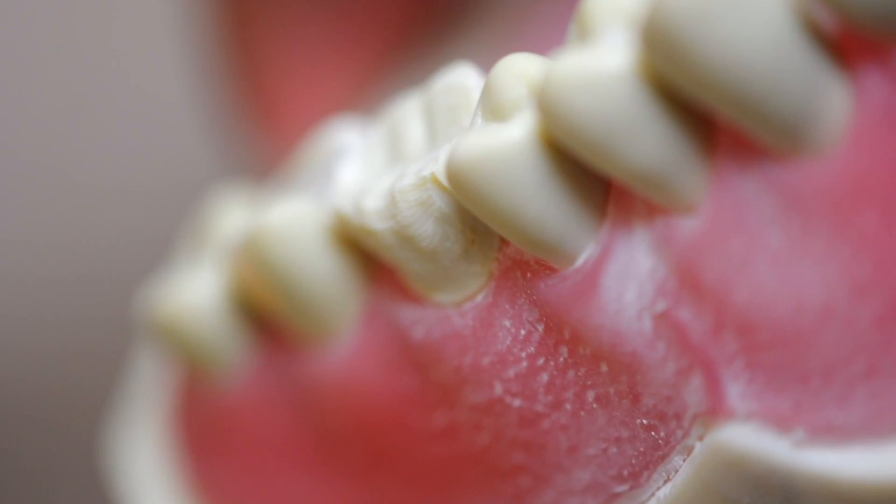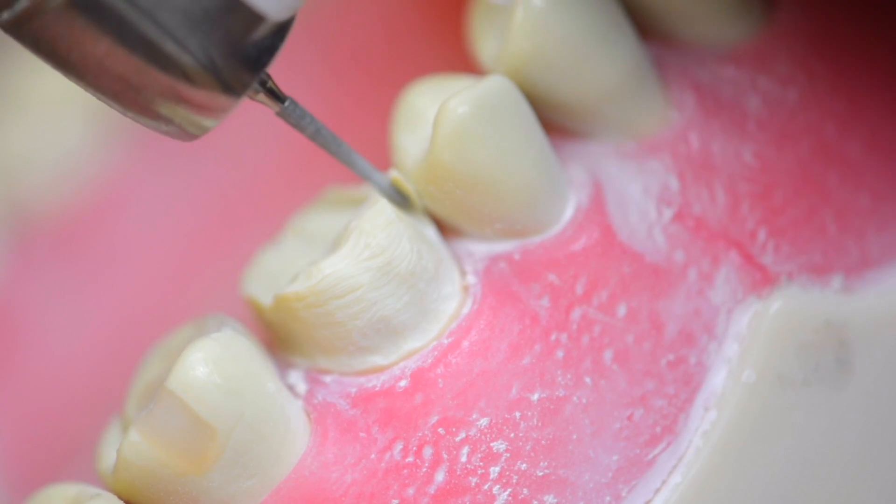Another critically important step involves interproximal reduction. This is a super technique-sensitive step, but if you understand the interproximal contours of the tooth and use a thin flame-shaped diamond, you'll be able to get through the step with ease. Check it out.